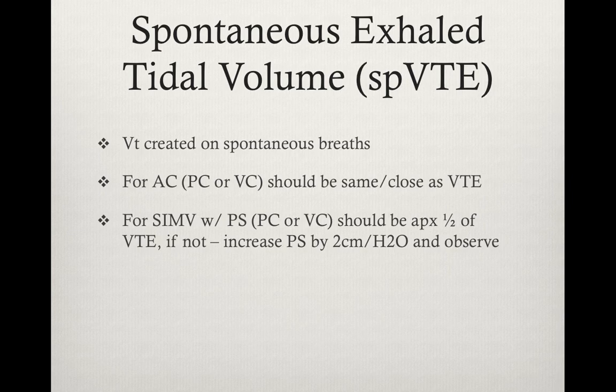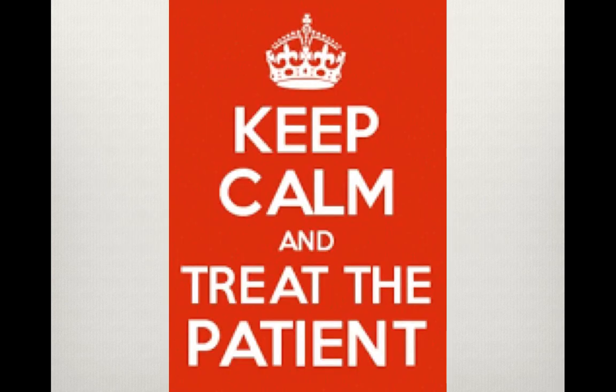And if we're not hitting about that half of regular exhaled tidal volume, then I'm going to increase my pressure support because my patient's having to work too hard for those spontaneous breaths. So we're going to increase the pressure support by 2 centimeters of water pressure at a time, and then observe for some good changes with those spontaneous exhaled tidal volumes.